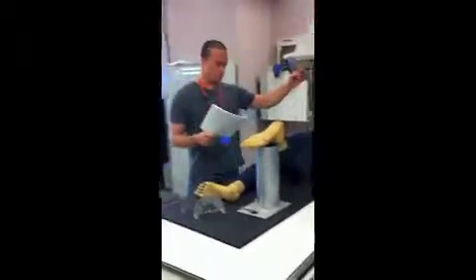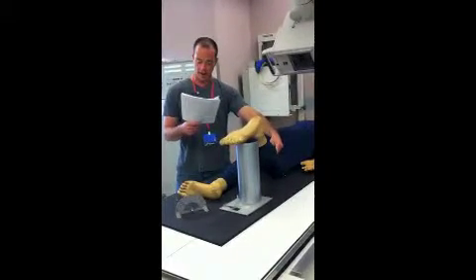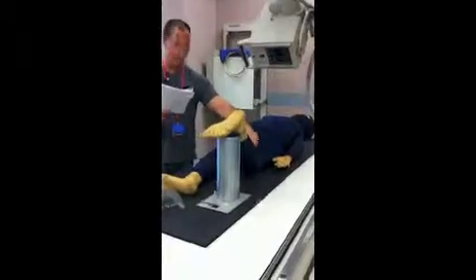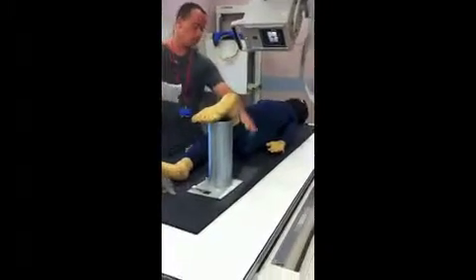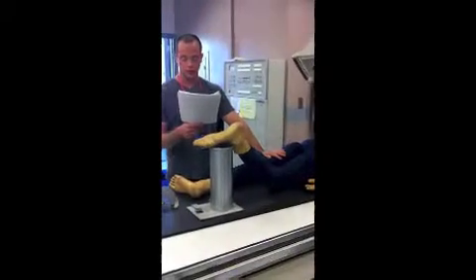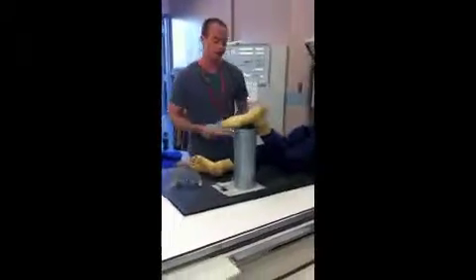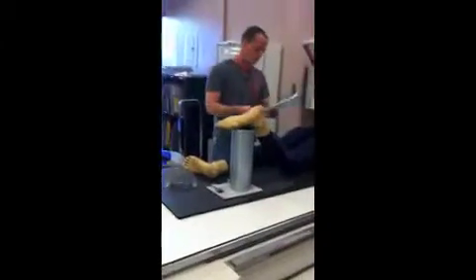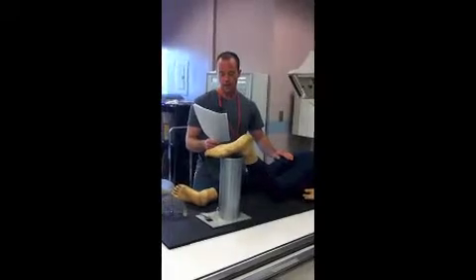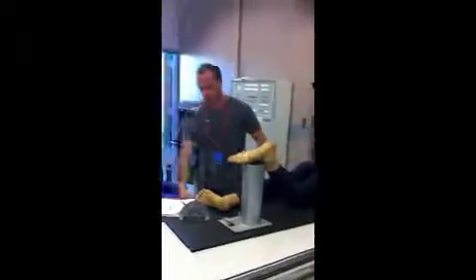The CR is perpendicular to the long axis of the lower leg and centered to the knee joint, right here, over the popliteal depression. You angle the tube 40 degrees when the knee is angled 40 degrees. You angle the tube 50 degrees when the knee is angled 50 degrees. They are both the same. And again, I'm going to be giving the technique of a regular AP knee at 65 and 5.